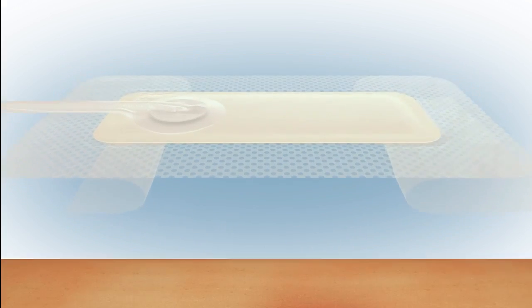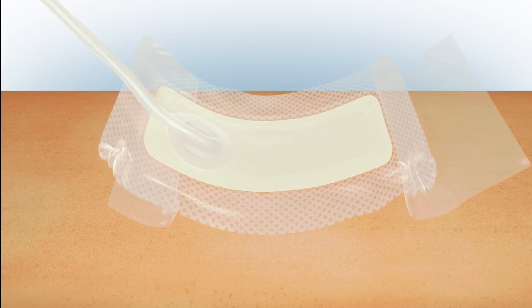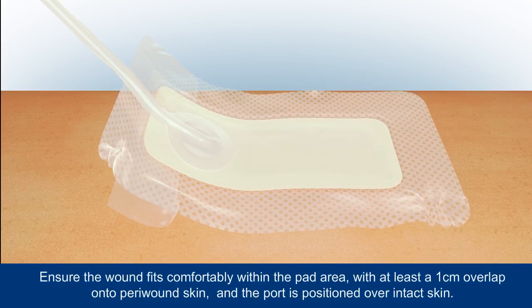Partly remove the backing from the dressing and position over the wound. A moderately exuding wound would take up no more than 25% of the pad area. Place the dressing centrally and flat over the wound and surrounding skin, making sure that the port is positioned away from the wound and is uppermost over intact skin.